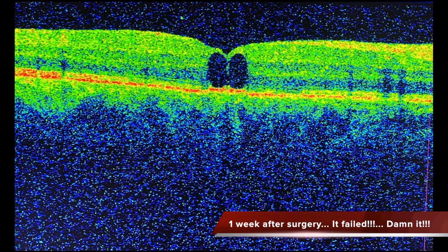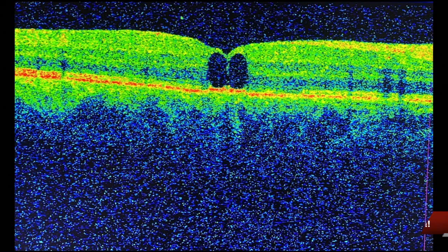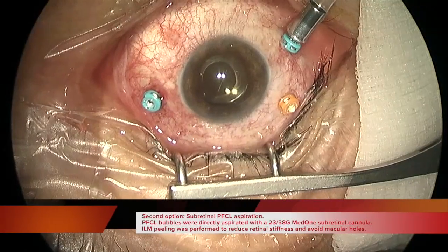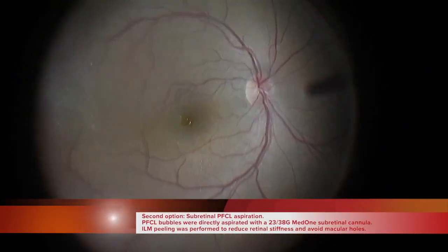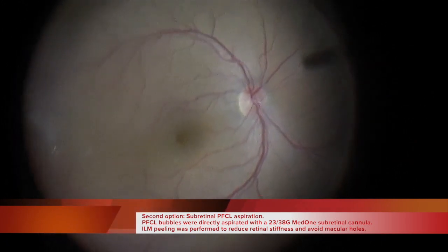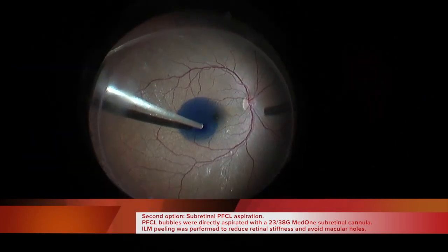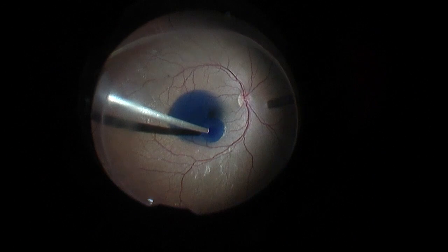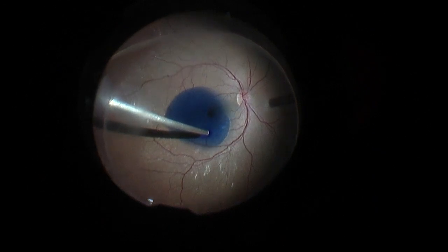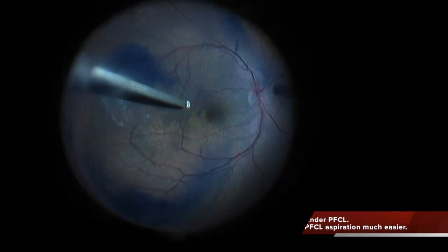Unfortunately the surgery failed and the bubbles were at the subfoveal area again. So in this case our approach was directly aspirating the bubbles from the subretinal space.